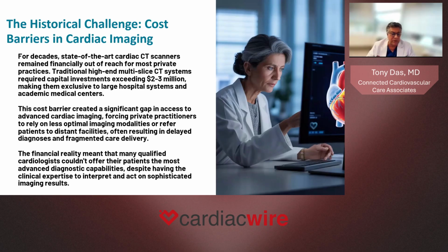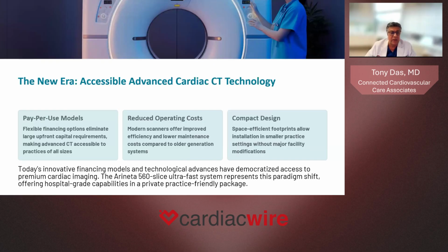They were there to do liver scans, to do other types of scans, soft tissue abnormalities, etc. But when you focus particularly on the cardiac sector, you want a high resolution, single breath hold kind of scanner that really focuses on the heart. And that's what we now have access to. So I think that was part of the traditional concept of not really having these scanners accessible for practices outside the hospital.